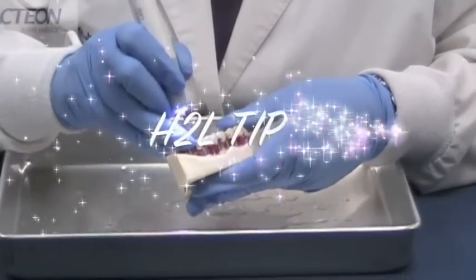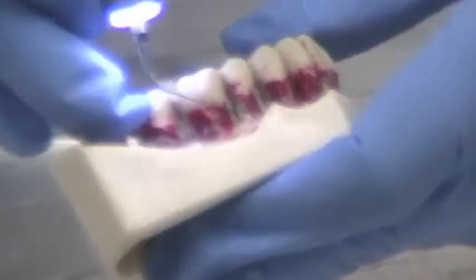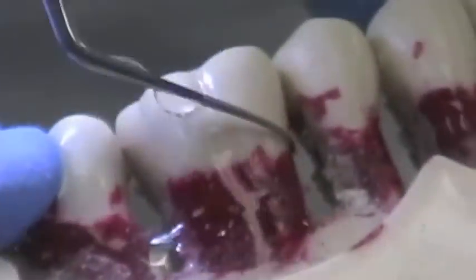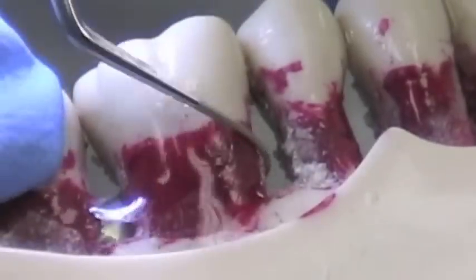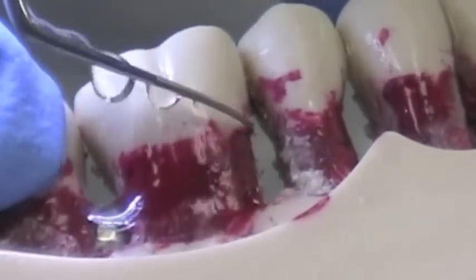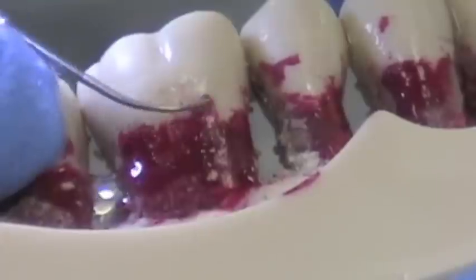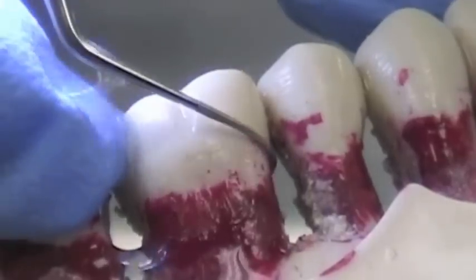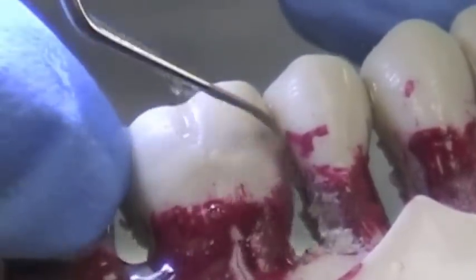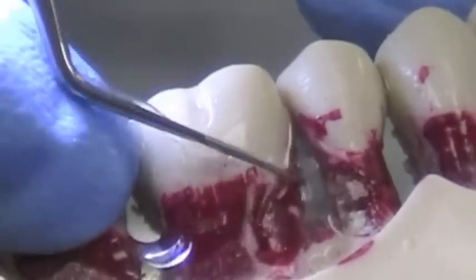Now we're going to demonstrate the H2L. The H2L is, again, a diamond coated tip. As you can see, great for posterior areas. The H2L is going to clean the buccal surfaces as well as the mesial of posterior molars. Very, very light — feather light touch.